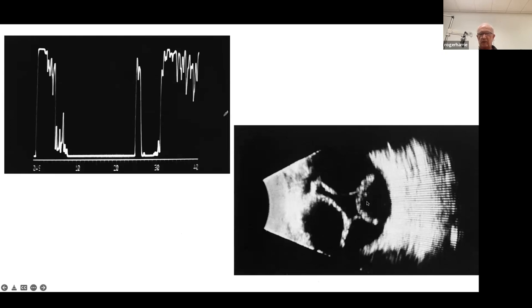As you said, it looks that way because it's attached to the vortex veins — they tether it so it can't extend beyond that, whereas a retina is not limited to that. So you get this scalloping, convex appearance. Mobility-wise, choroidals tend to be more rigid — they're kind of fixed because they're tethered down by the vortex and don't move as much. They tend to have the scalloped appearance — that's a classic choroidal.